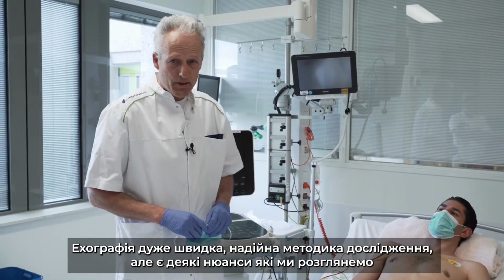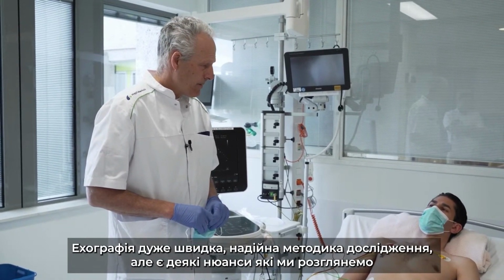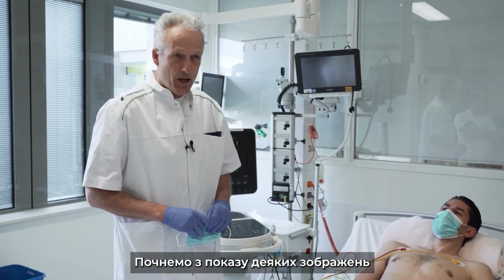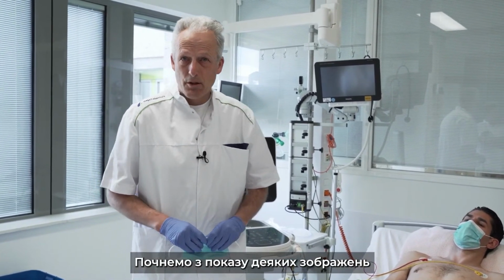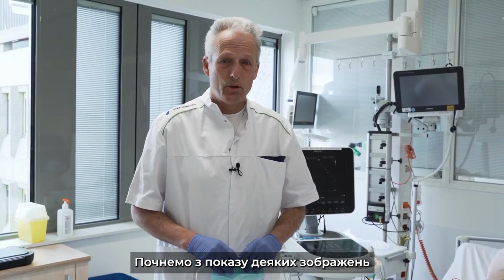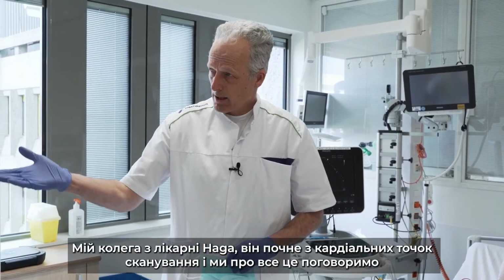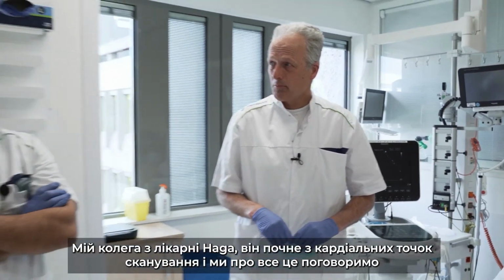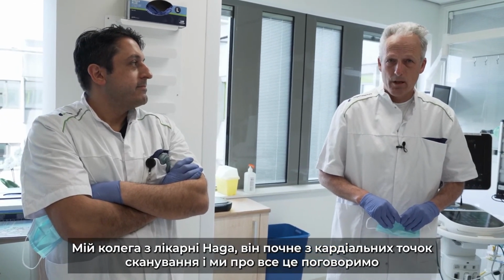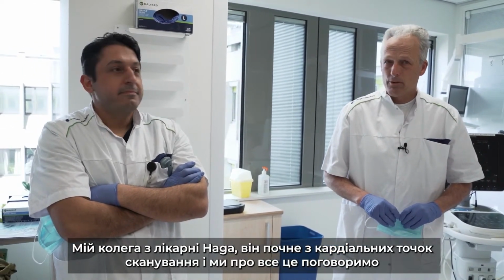Echography is very fast, it's very reliable. There are some pitfalls we will tell you about, and it's fast. So we will just start showing the several windows now. My colleague here from Haga Hospital will start with the cardiac windows, and we will talk about those.